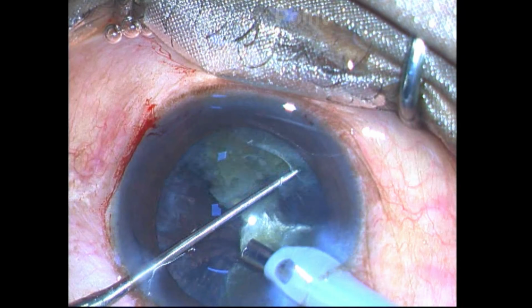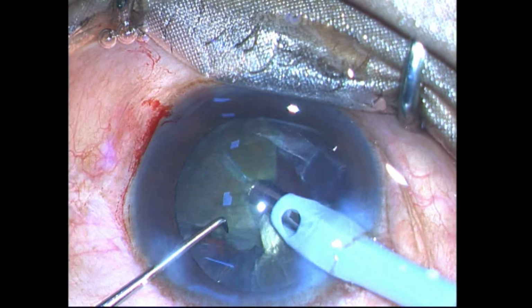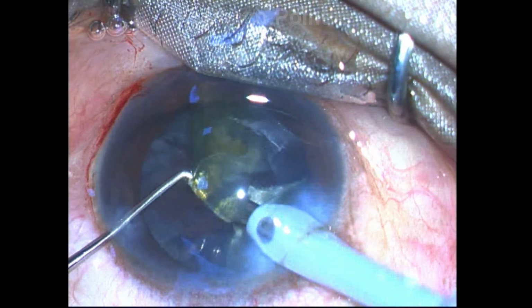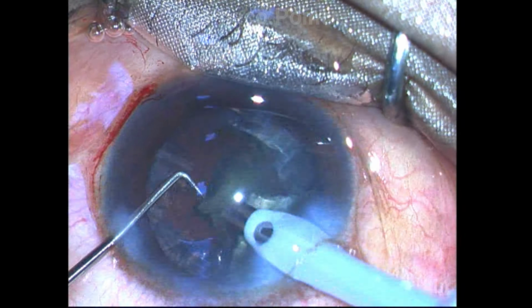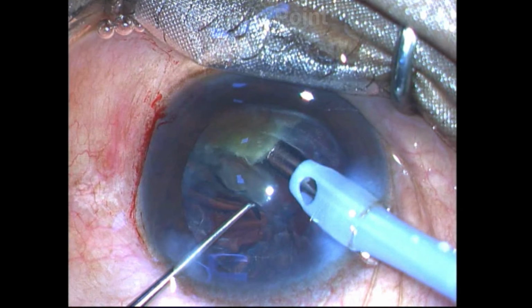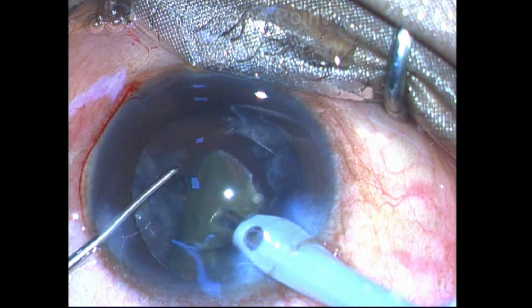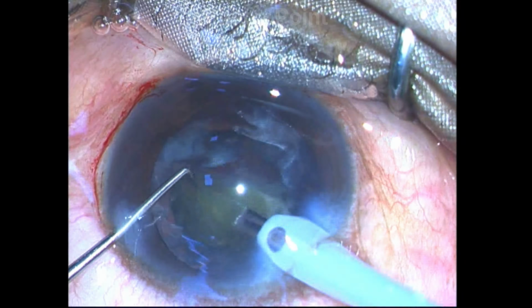Once the nucleus is rotated, the nucleus is then impaled in foot pedal 3, the nucleus fragment held in foot pedal 2, brought up in 2 and then further emulsified in foot pedal 3. And upon completion of fragment emulsification, the foot pedal moves to foot pedal 1. In this manner, the nucleus is downsized and nuclear emulsification is carefully and in an extremely controlled manner completed.